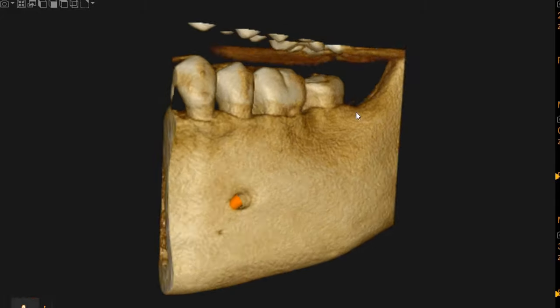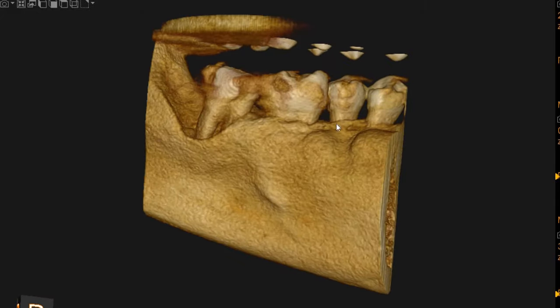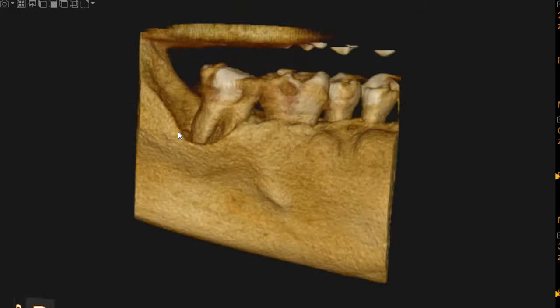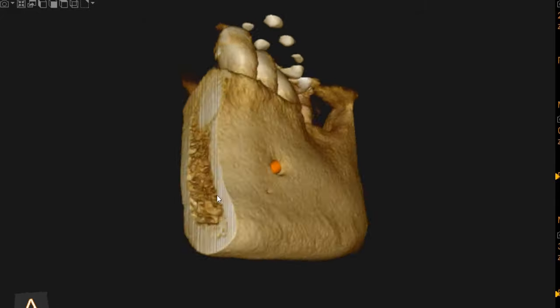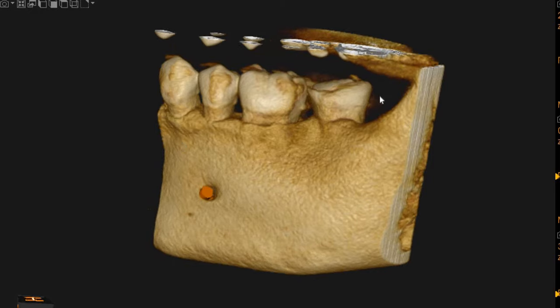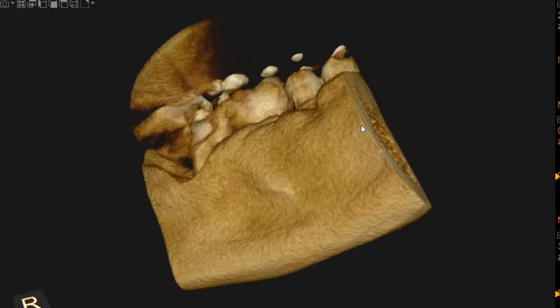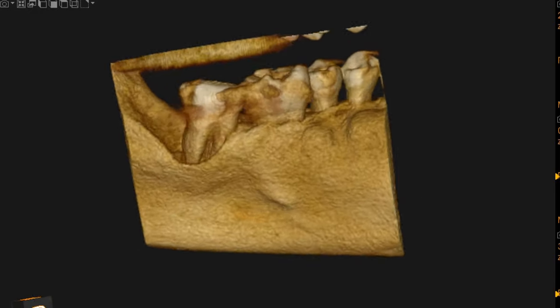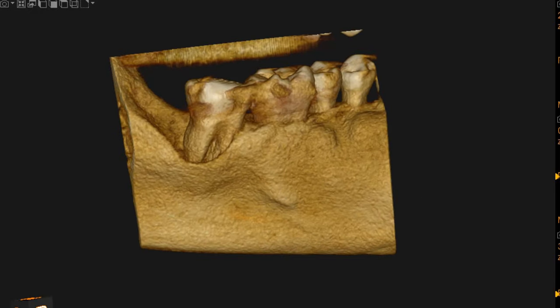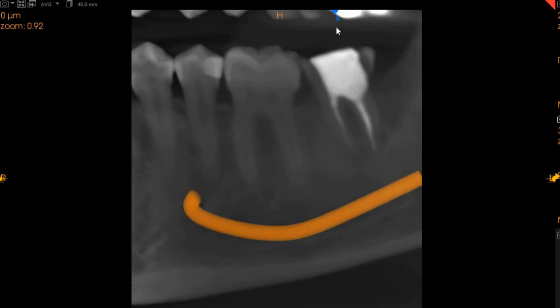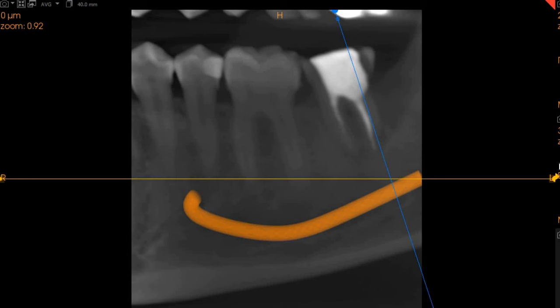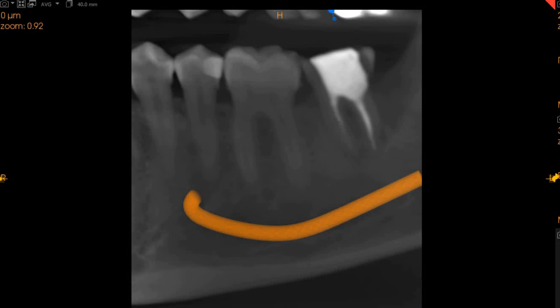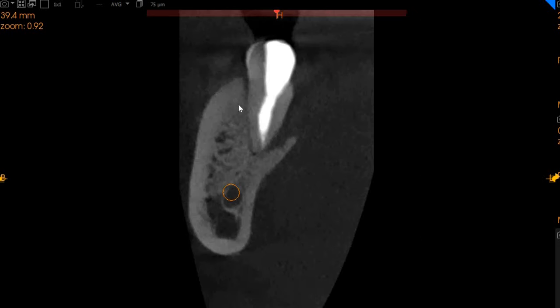Assalamu alaikum, Ultra Scan Diagnostic. This is the CBCT of the patient that you had requested. The area of interest is the lower left seven, with a fracture on the lingual aspect. This is the sagittal view of the tooth, and now we're going to focus on the transaxial view — this is the transaxial view.